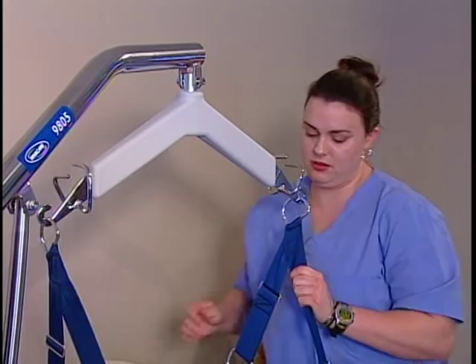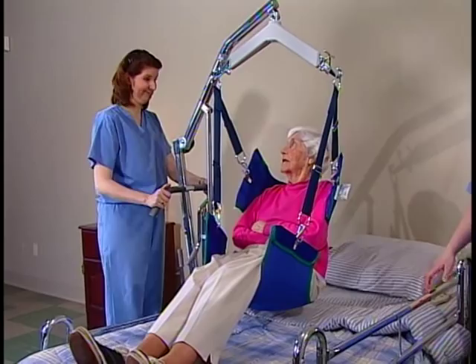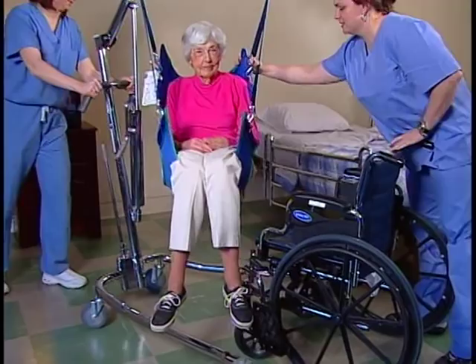Now pump the unit several more times to lift the resident a few inches off the bed. When clear, gently swing their feet away from the bed. Use the steering handle to pull the lift away from the bed. Stand squarely behind the lift, place both hands on the push handles, and push. Never pull or push on the boom — use the handles to push it into position over the wheelchair.